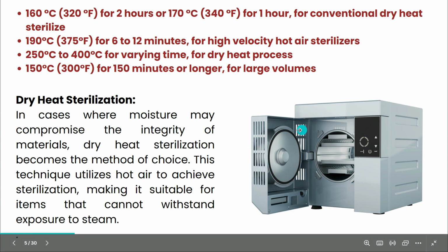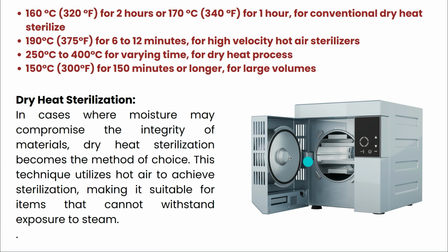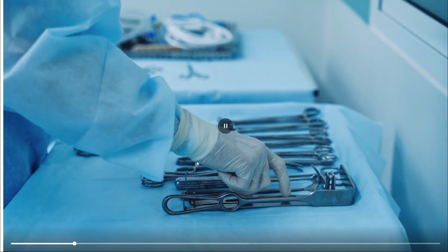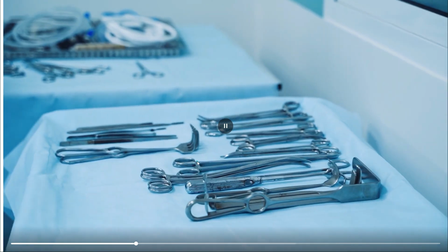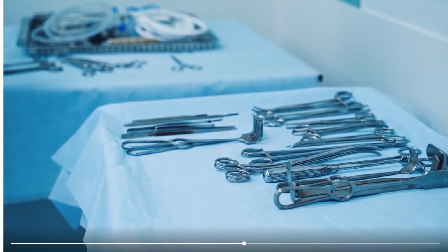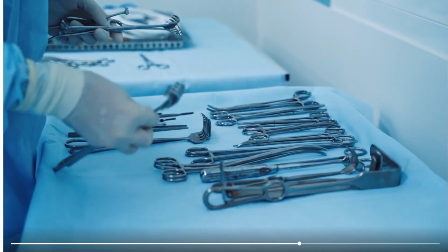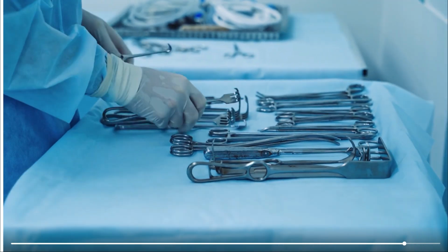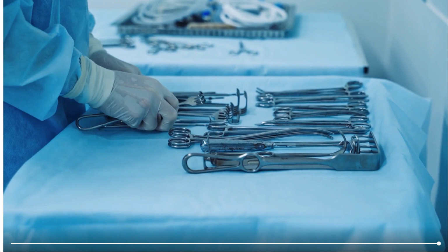It is majorly practiced in cases where moisture may compromise the integrity of the material you are looking to sterilize. This is majorly practiced in most of the healthcare sectors. Here you can see before the operations or any surgical practice is carried out, these instruments are sterilized, and the majority of them use the heat sterilization process.